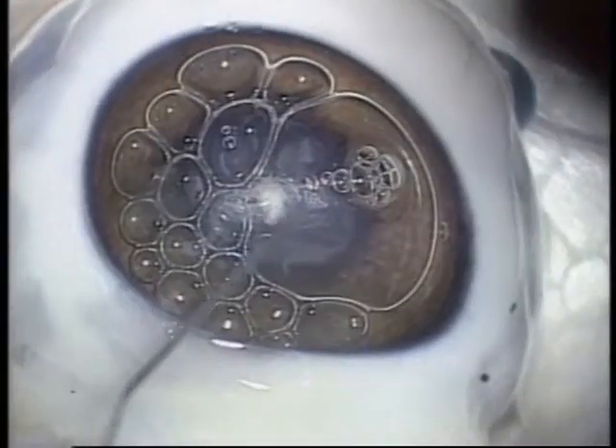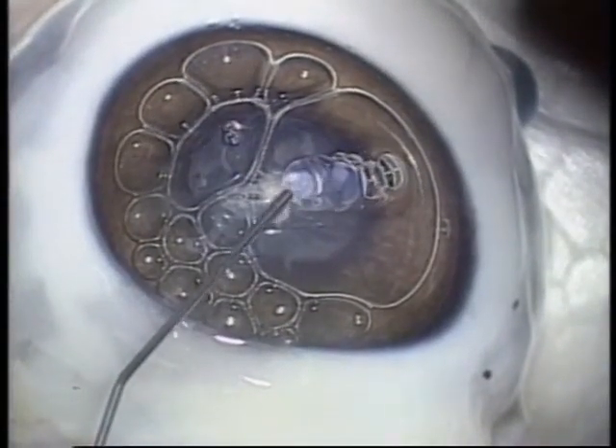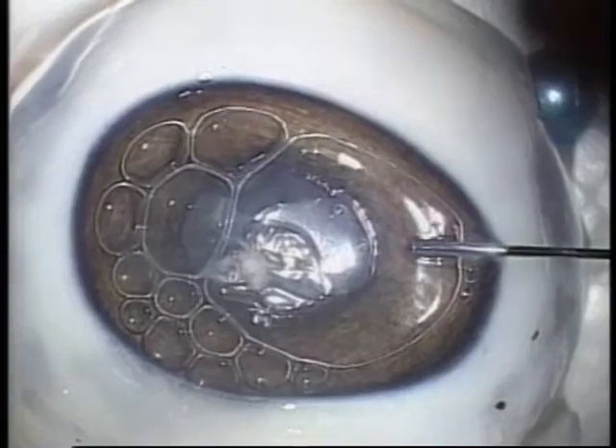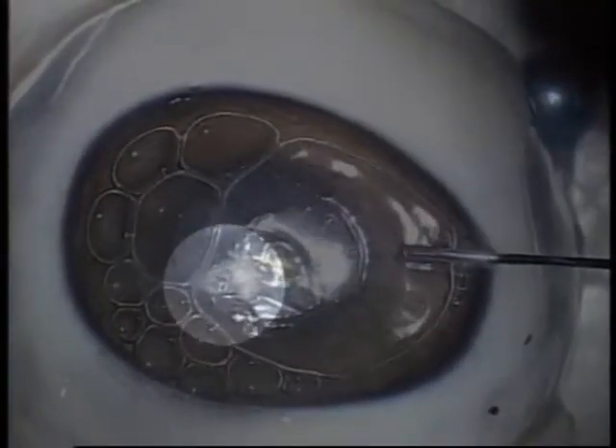Two incisions were made in the pig's cornea using an 18-gauge needle. One was coated with viscote. Subsequently, air was injected through the puncture made in the anterior chamber. I checked to see which incision air would leak from first. As shown here, air leaked from the incision that was not coated with viscote.